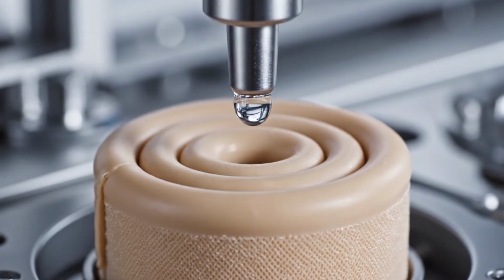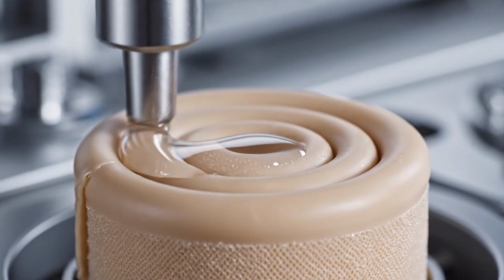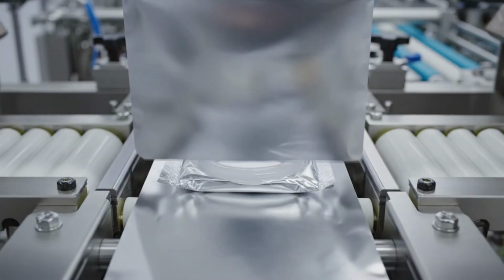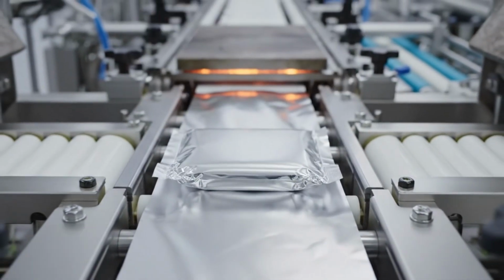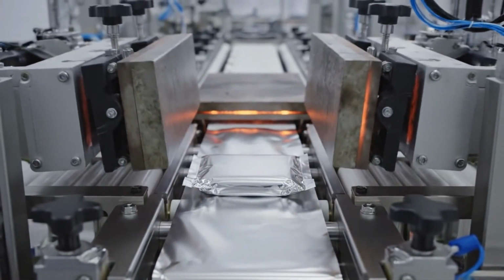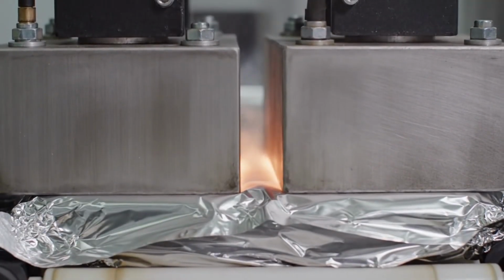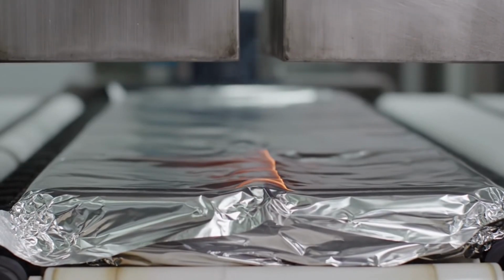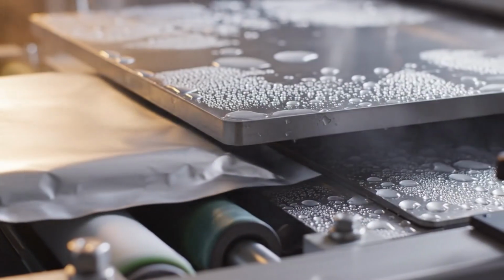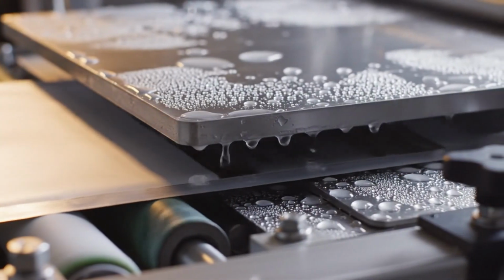The amount of lubricant is calibrated to the milligram to ensure consistency across millions of units. This moment seals the product from the outside world for the next 5 years. We use controlled heat to melt the inner plastic lining, creating a bond that no bacteria or air can penetrate. Rapid cooling locks the seal, ensuring the package remains tamper-proof.